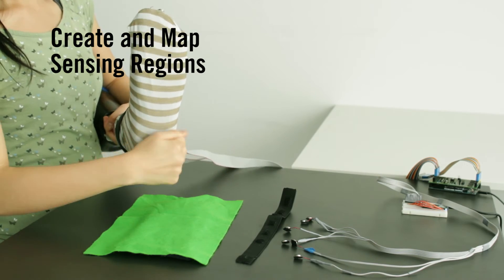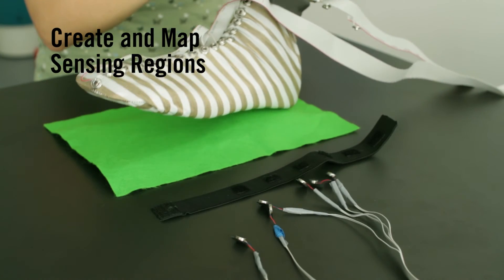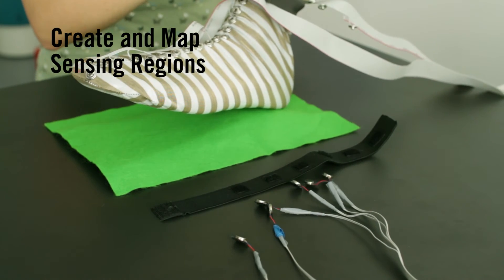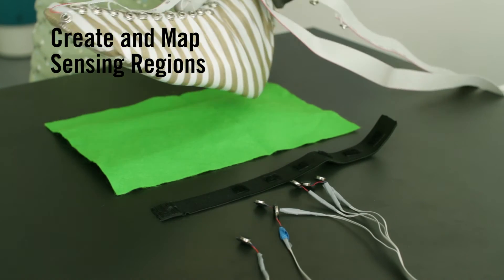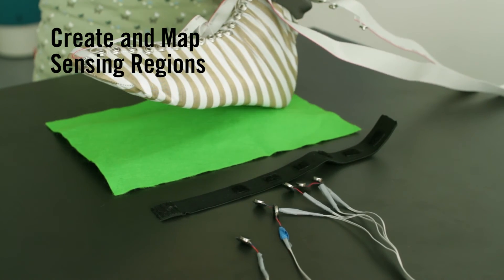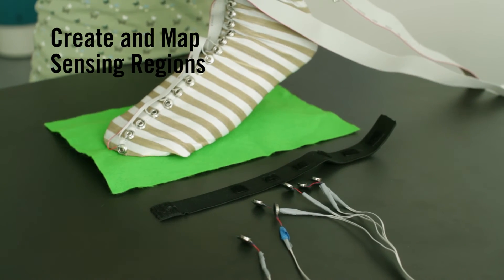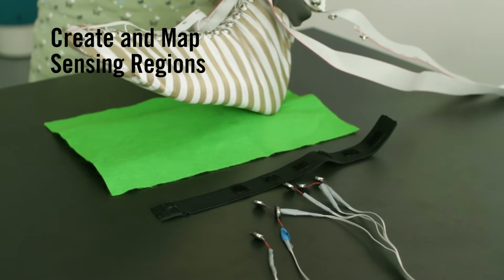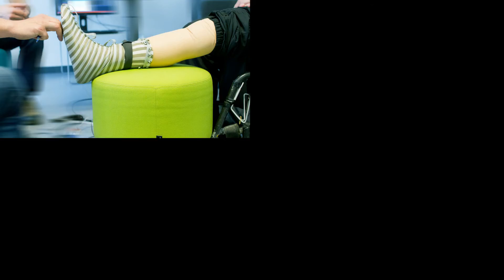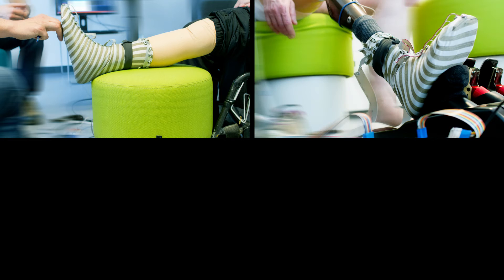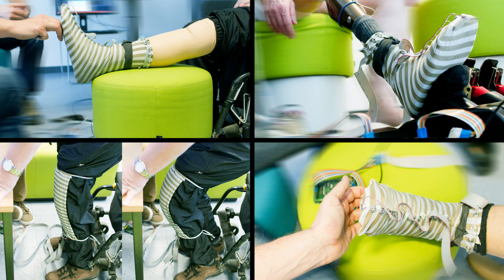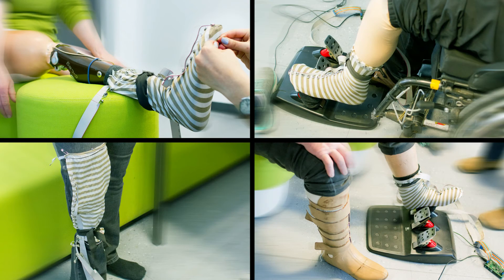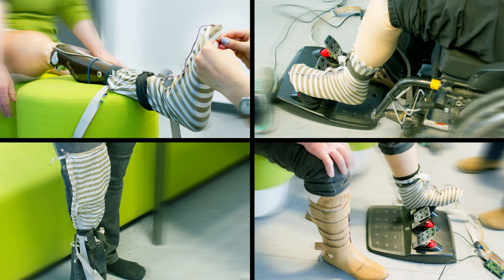ProCover allows users to adapt its functionality to fit their unique needs in a variety of different situations. In a pilot study, we had prosthesis users test the utility of ProCover in the context of different scenarios of their concern.